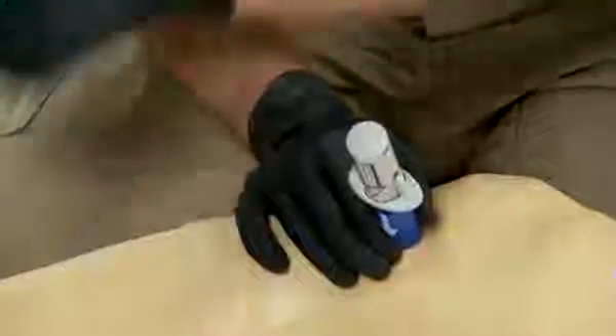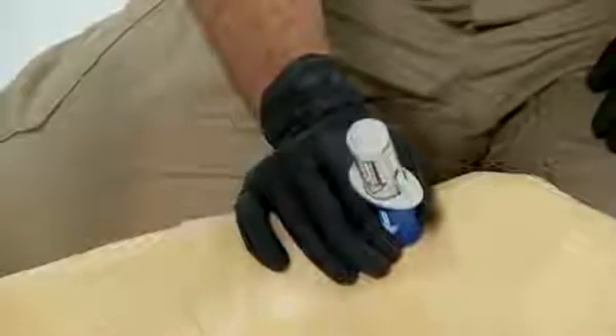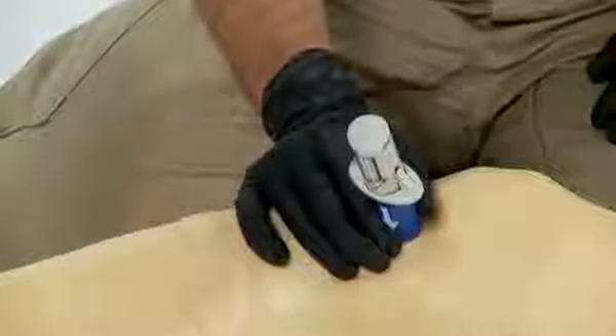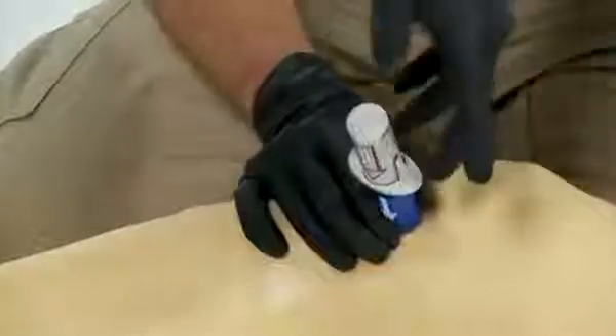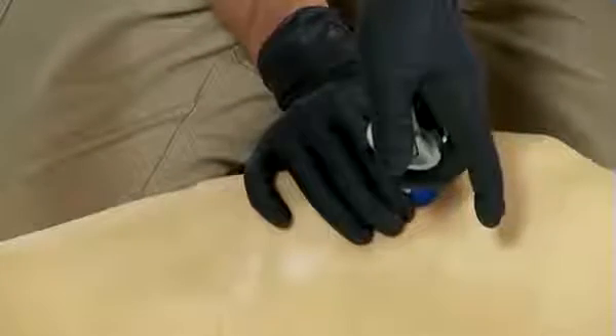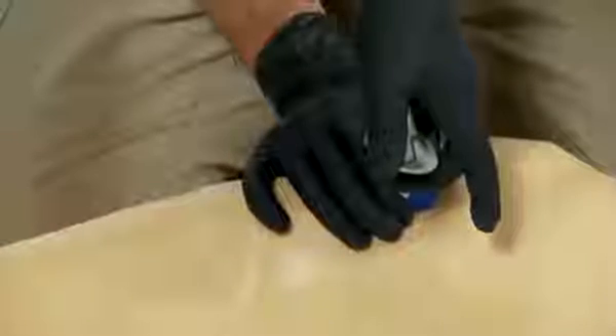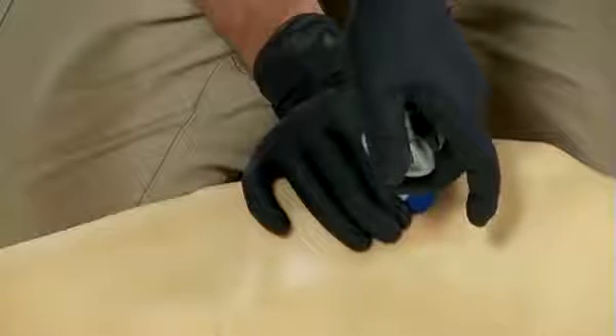Do not discard the red safety latch because we will use it again later. While continuing to hold the barrel firmly against the site, place two fingers of your dominant hand under the wing portion and the palm of that hand on top to stabilize when triggering. Use consistent and gentle downward pressure to trigger the BIG. Note that no extra force is required.